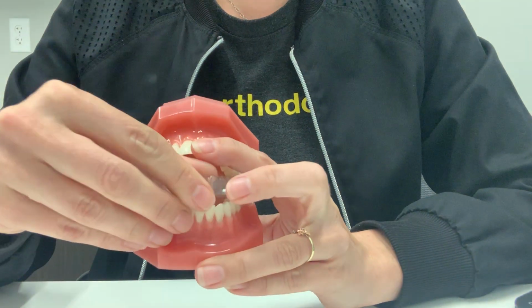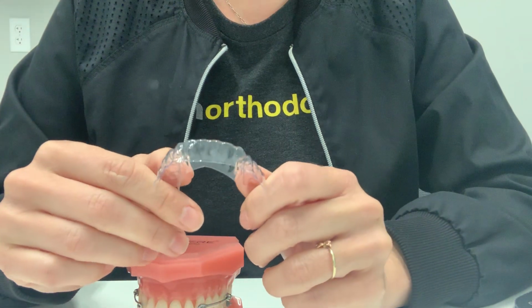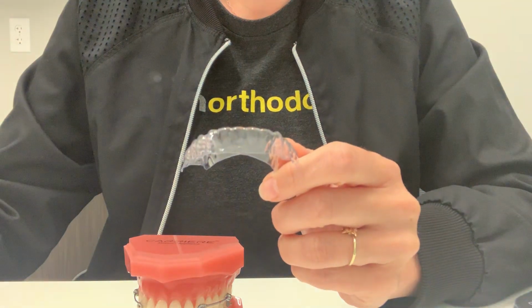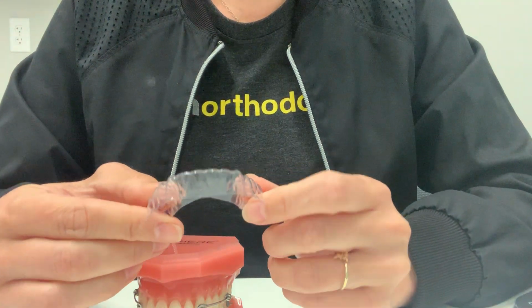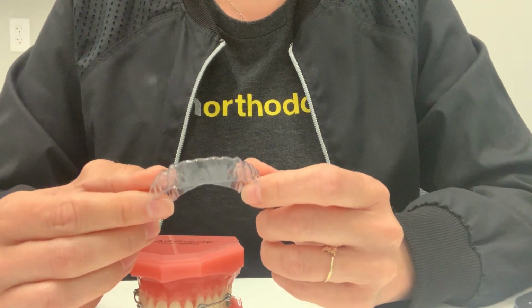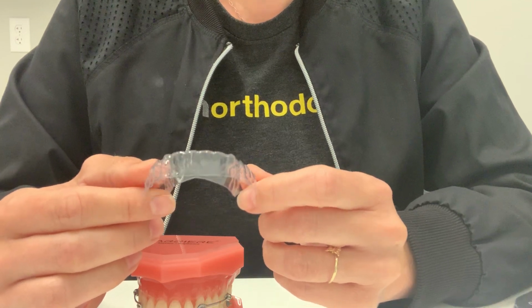If you have a removable Essex retainer, it should be taken out to eat and brush as well. The retainer should always be in the case, which we will give you, or in your mouth. Never wrap it up in a napkin or leave it on a tray somewhere because it will get thrown away. If the retainer is in the case and there is a dog around, keep the case up high where the dog can't get to it.